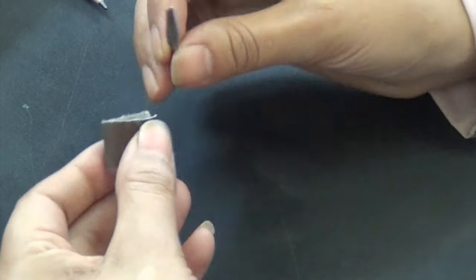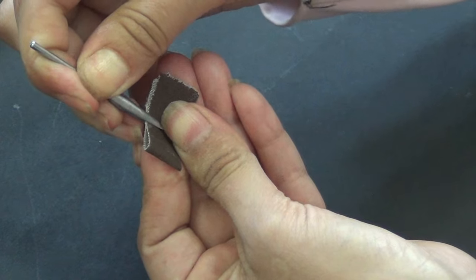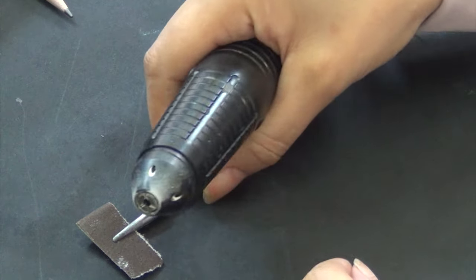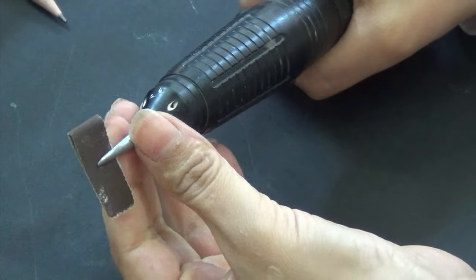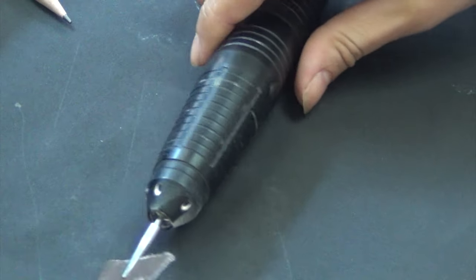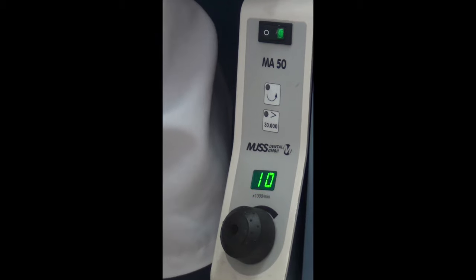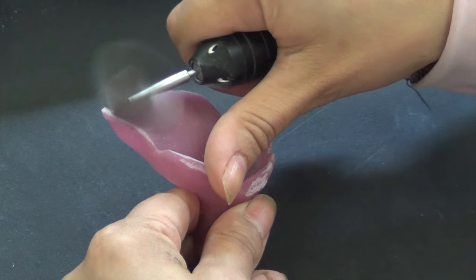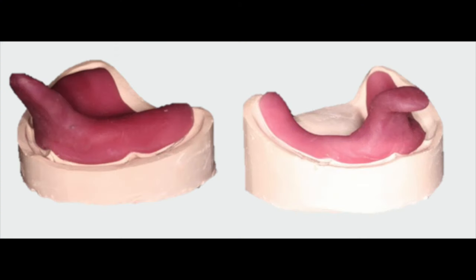To polish the edges of the tray, make sure that you are not reducing the size of the tray. Use sandpaper secured on a mandrel, and attach the mandrel to the straight handpiece as you did previously with the acrylic burr. Lower the speed of the handpiece motor to 10,000 rounds per minute. The edges should be smooth and extending 2 mm away from the depth of the sulcus, except posteriorly, where they should extend to the distal end of the denture bearing area, both in the maxilla and the mandible.